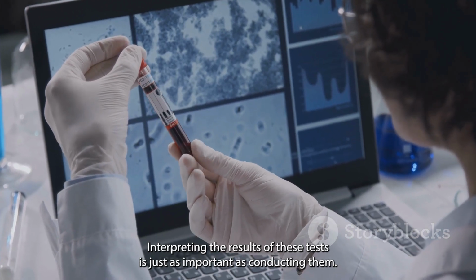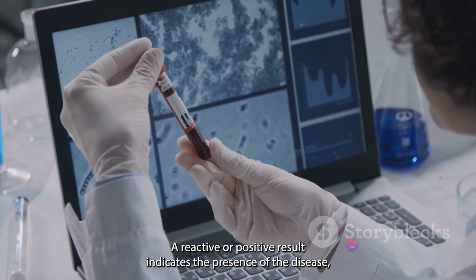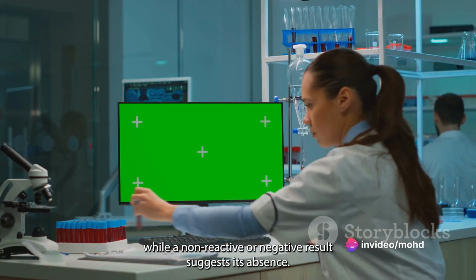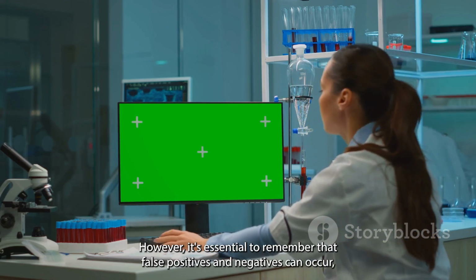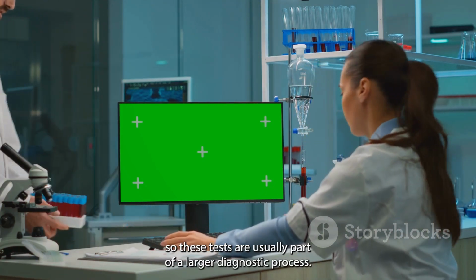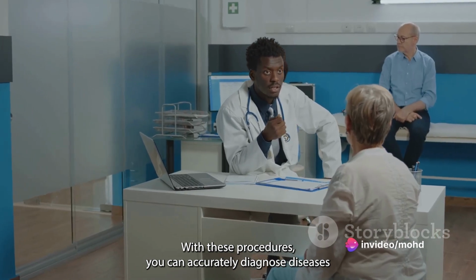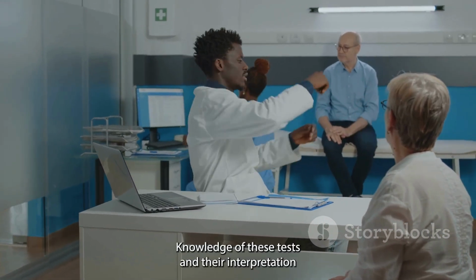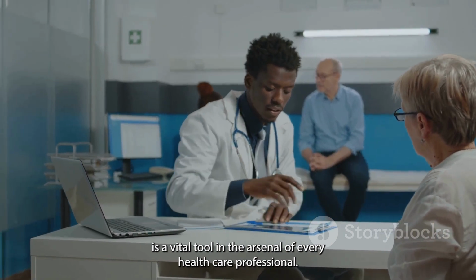Interpreting the results of these tests is just as important as conducting them. A reactive or positive result indicates the presence of the disease, while a non-reactive or negative result suggests its absence. However, it's essential to remember that false positives and negatives can occur, so these tests are usually part of a larger diagnostic process. With these procedures, you can accurately diagnose diseases and help patients receive the appropriate treatment. Knowledge of these tests and their interpretation is a vital tool in the arsenal of every healthcare professional.